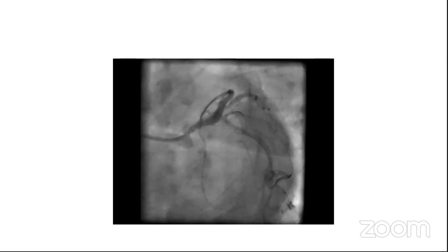What is your comment, Dr. Karim, up till now? I think you have reached a very good result till now. You corrected the pinching and the carina shift at the ostium of the LCX, and I believe the patient's symptoms improved after opening this large circumflex.